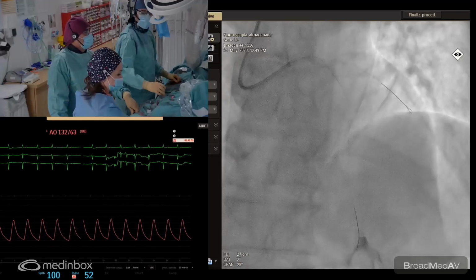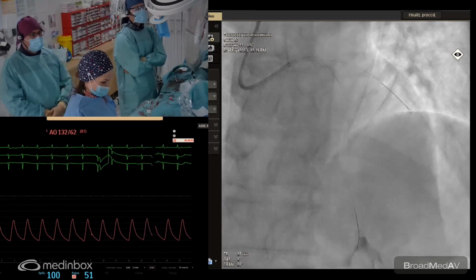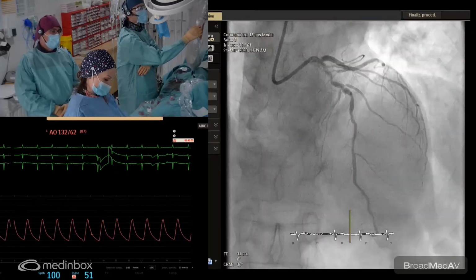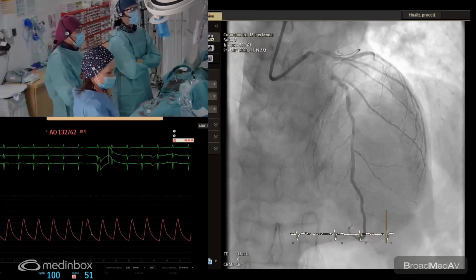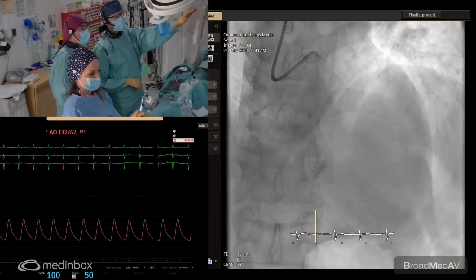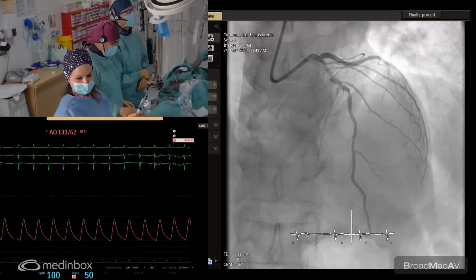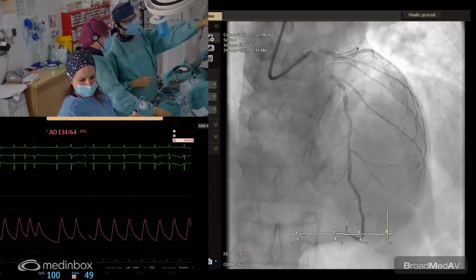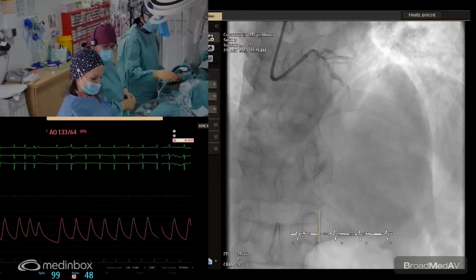We're going to try to use a very long stent, 3 by 48, according to the measurements of the OCT. Yeah, probably 48 is a good option. We have some space distal to this aneurysm to land if the lesion is a little bit shorter. But yeah, we want to land distally to this diagonal, third diagonal. Probably 38 is not enough. Okay.